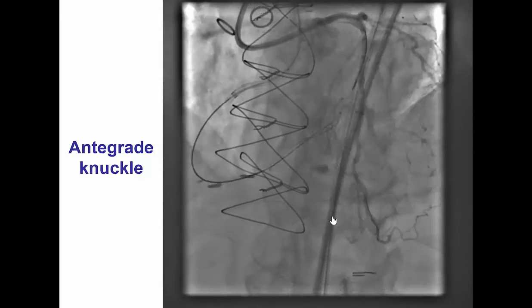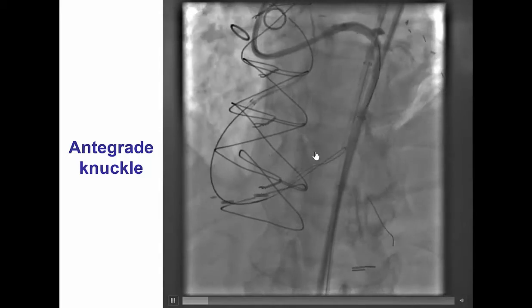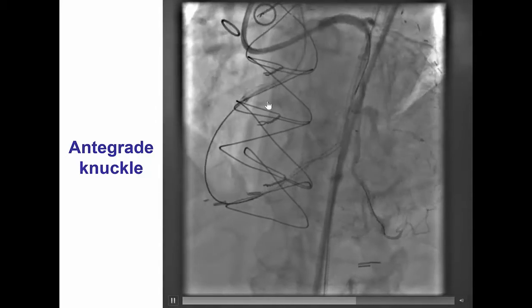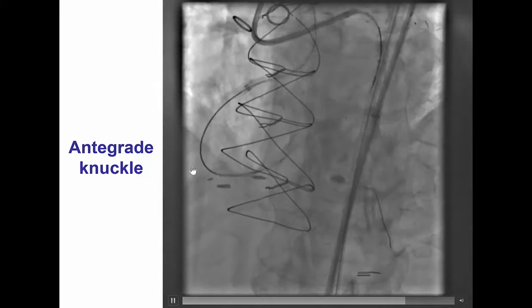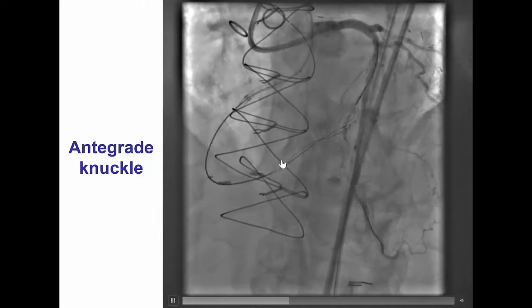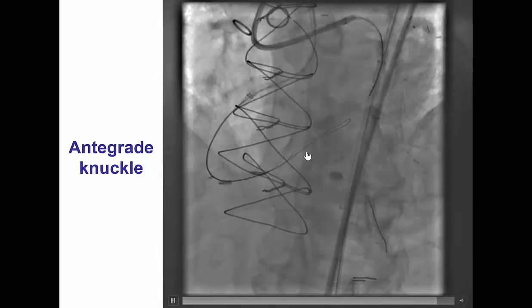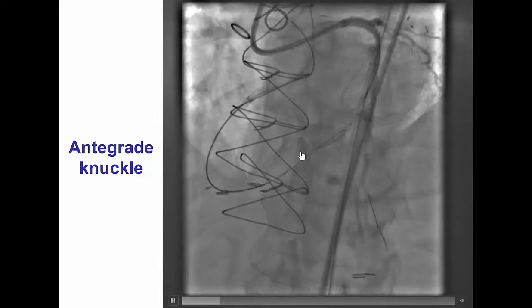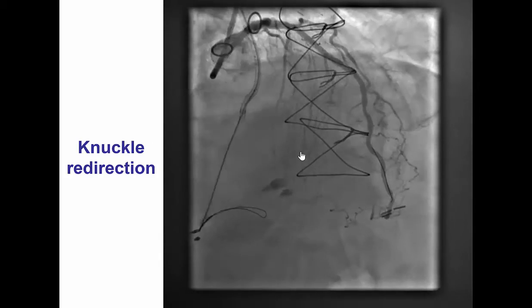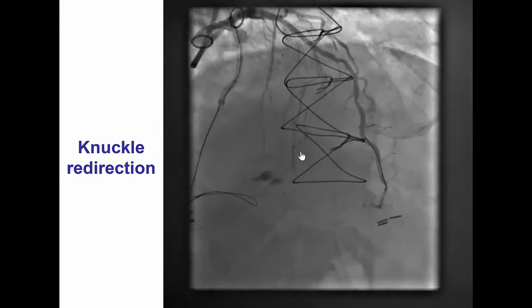Retrograde attempts were unsuccessful; there was a small septal hematoma, therefore antegrade crossing attempts were undertaken. The wire quickly went subintimal and prolonged attempts led to crossing into the posterolateral branch, but the wire was subintimal, so it was redirected with a knuckle to the posterior descending artery.